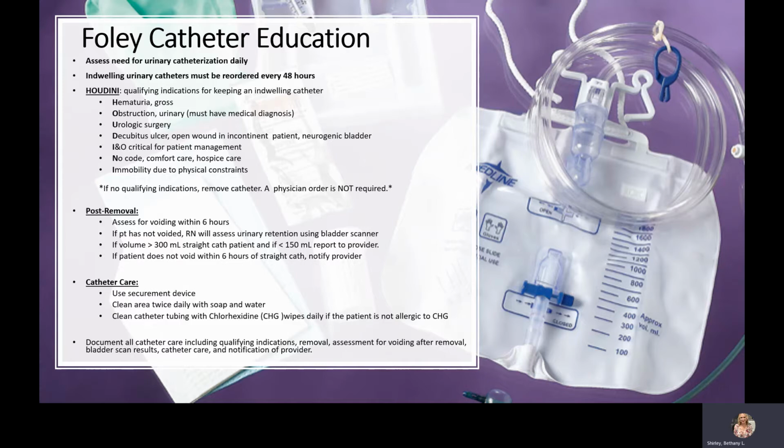If they have any of these qualifying indications, then it is appropriate to keep the indwelling catheter. If there are no qualifying indications, then the catheter should be removed. And it is important to note that a physician order is not required to remove the urinary catheter.